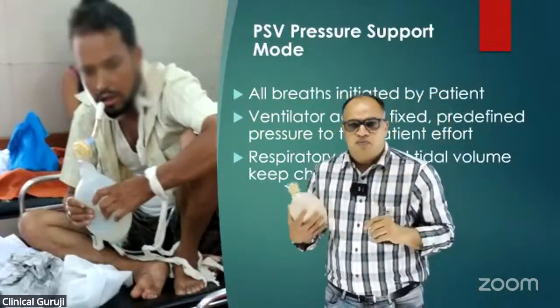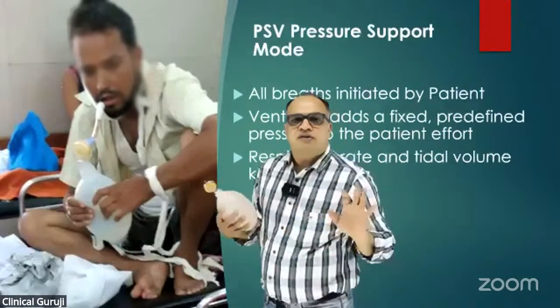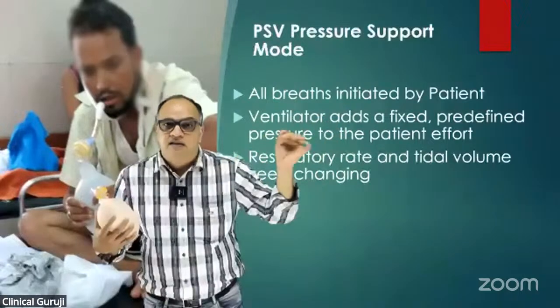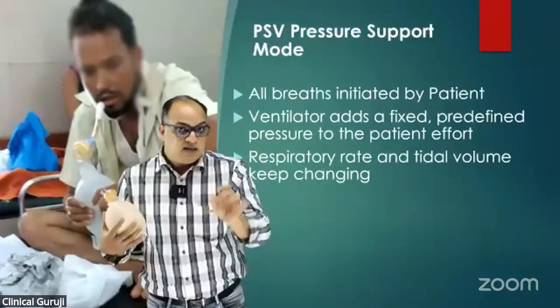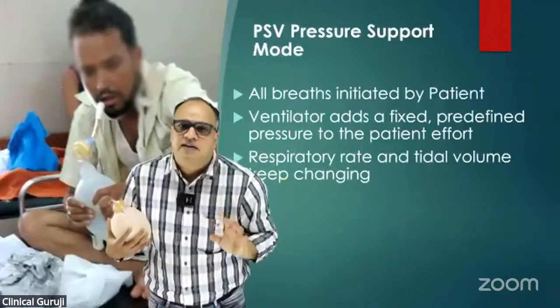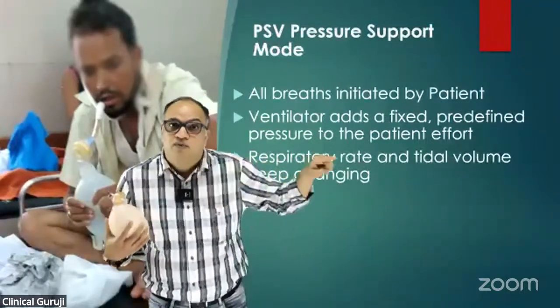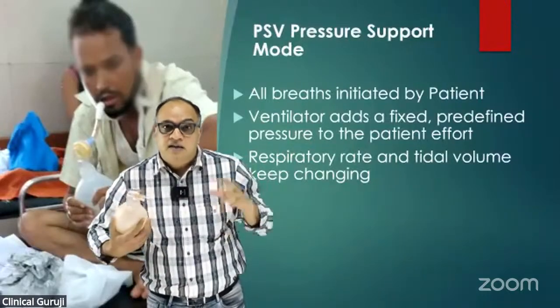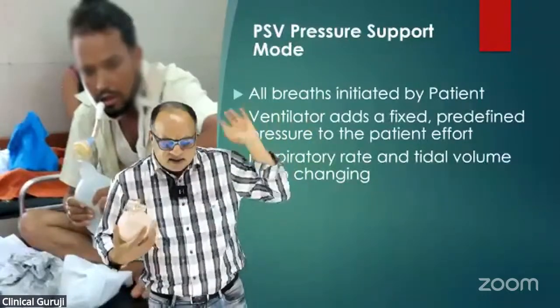This was a good mode because the patient was absolutely comfortable. Whenever you see patient-ventilator dyssynchrony on your ventilator, do one thing. Maybe put him on PSV with a pressure support of 15 or 17 or something like that and observe what the patient wants. If he is trying to take too much air in, probably your flow is less. But this is a talk for a different day.